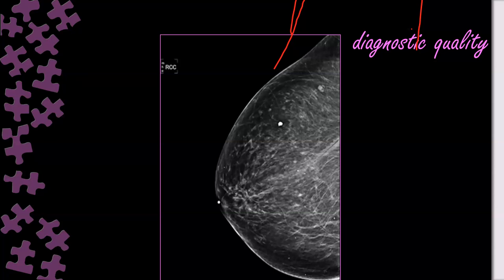This is craniocaudal view. Inadequate CC view. Yes. Because mammary fat is also not depicted. Nipple in central and in profile.